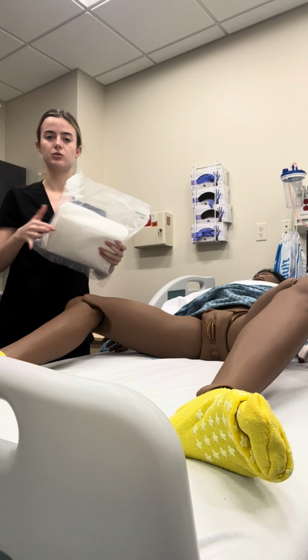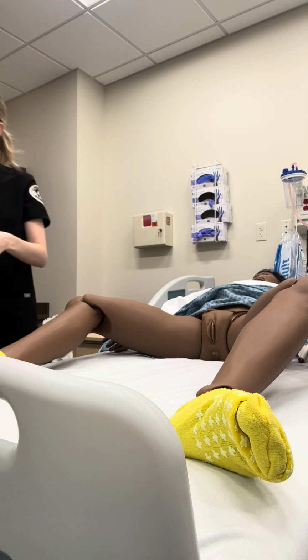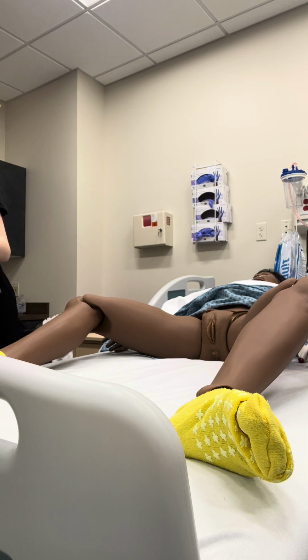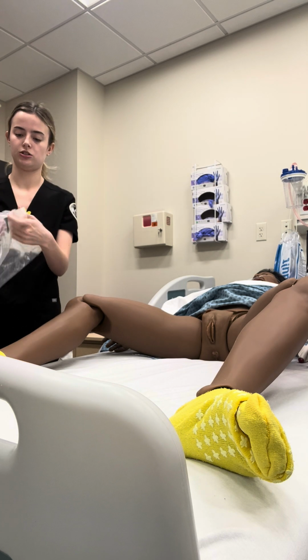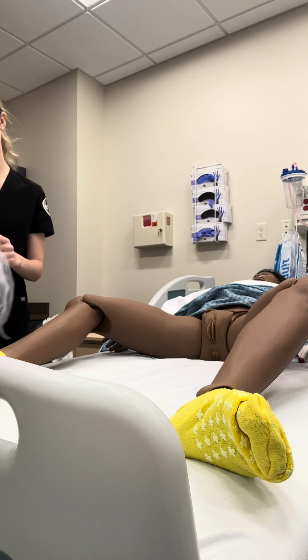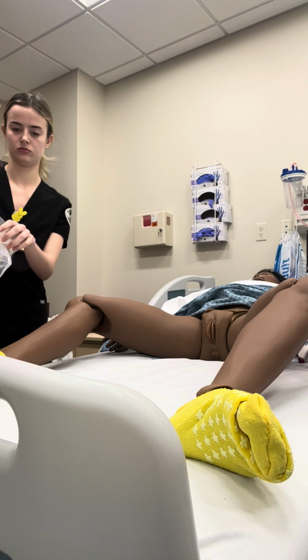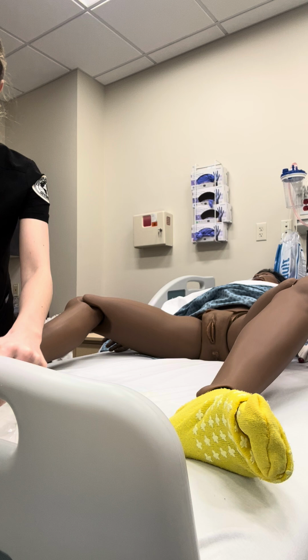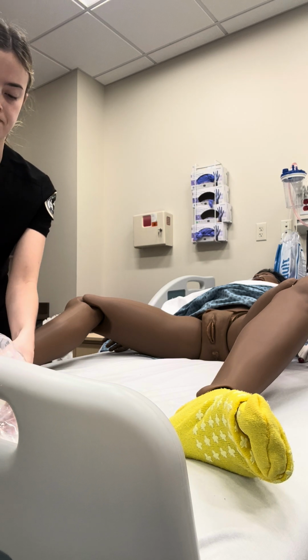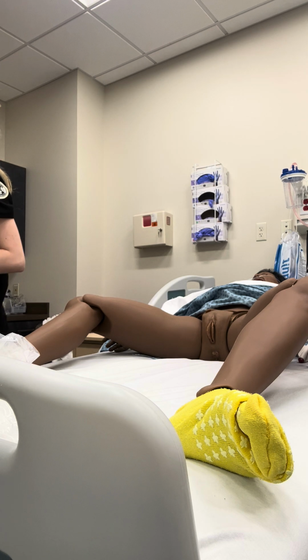So I'm going to obtain my Foley kit. I'm going to take this out of the wrapper, and I'm going to use the wrapper as a trash bag at the end of the bed. Okay. And then I'm going to set up my sterile field.